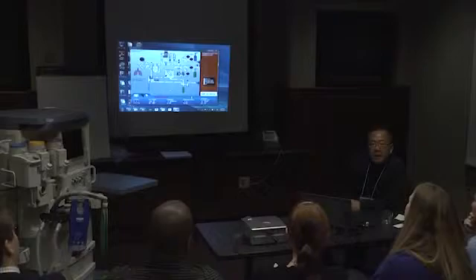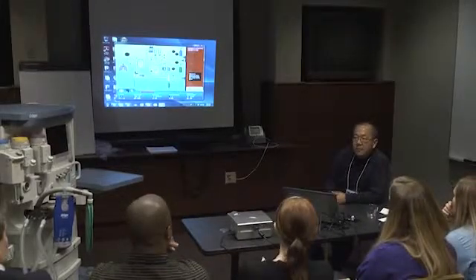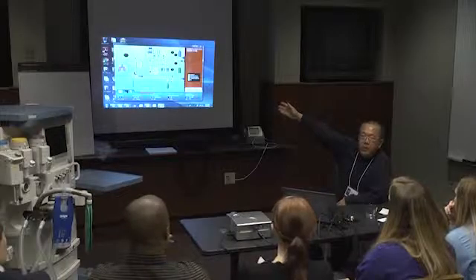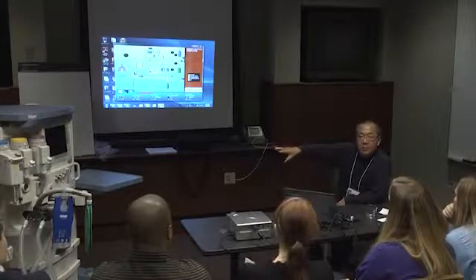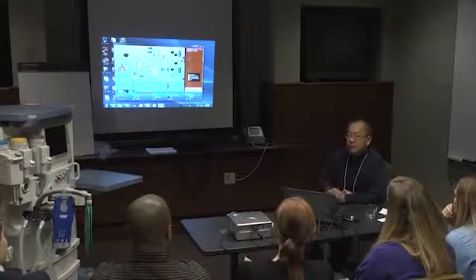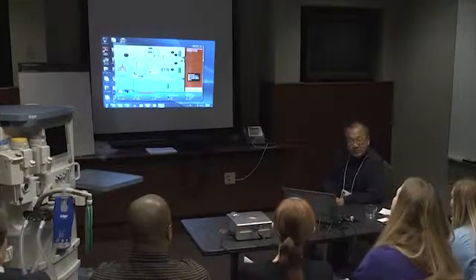Okay. Now, you call the tech and you say, bring me another oxygen tank. And he goes, guess what? The whole hospital is down. And guess what? By the luck of the draw, you are the furthest, remotest OR in the Northwestern hospital. So we're going to service all the main ORs first, and then we're going to get to you. But realistically, I'm being honest with you, we won't get to you before your case is over. And you know you're going to run out of oxygen before your case is over. Because now you know you have 30 minutes, not 120 minutes.